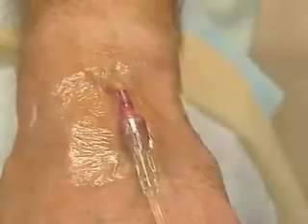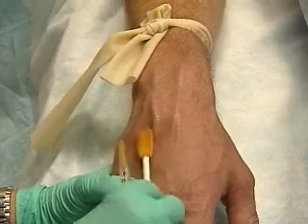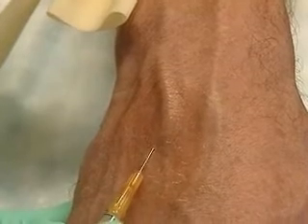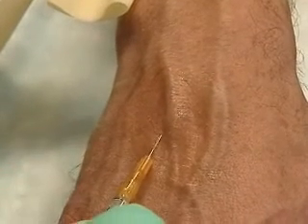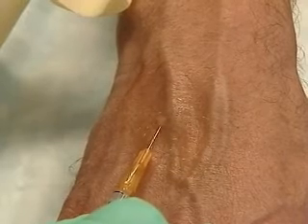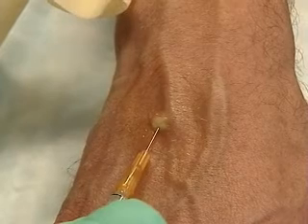The intravenous line insertion can be uncomfortable for some patients. If time allows, you can numb this delicate area with a subdermal application of lidocaine. You will inject just beside, not into the vein, and just below the surface of the skin.